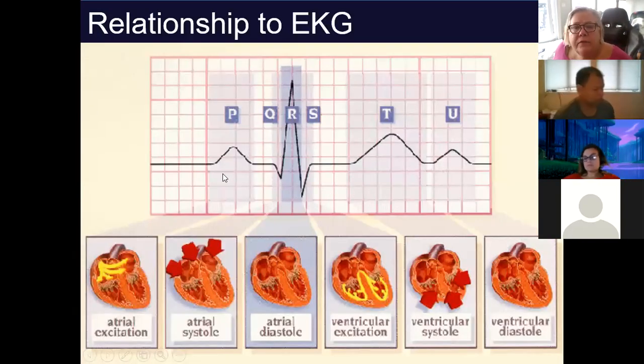All right. So here's your classic EKG, as I like to refer to it, our soap opera EKG. Everybody who's going to die in the hospital goes from this beautiful complex that's well recognizable to flatline, with rarely anything in between. That's not usually how it works in reality, though. But nonetheless, you've come to recognize this probably even before you came to nursing school. These are the different complexes and waves that are important within EKGs.